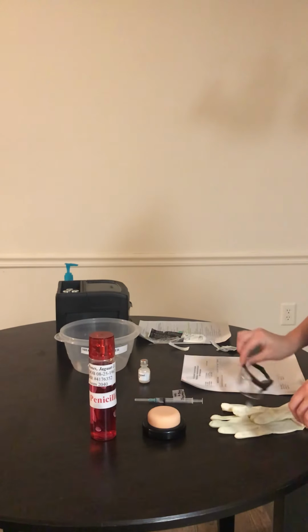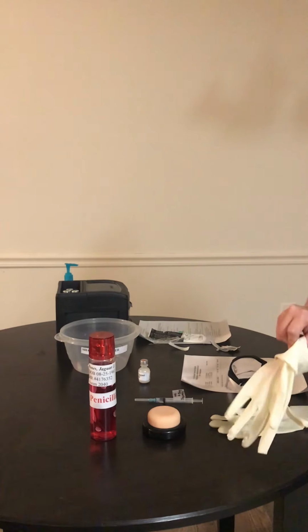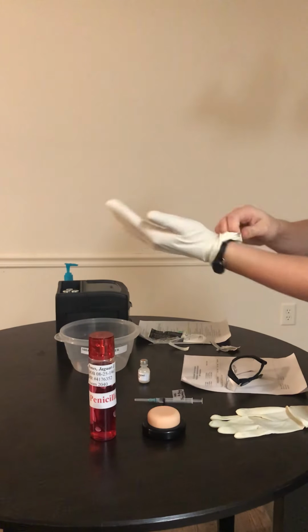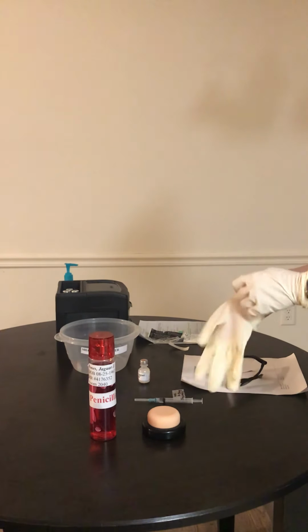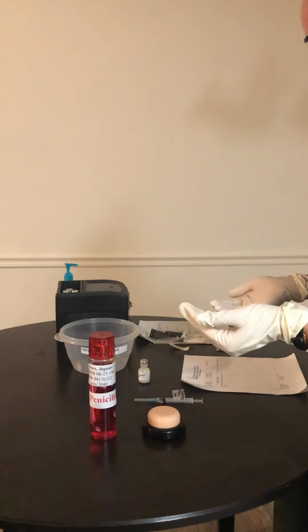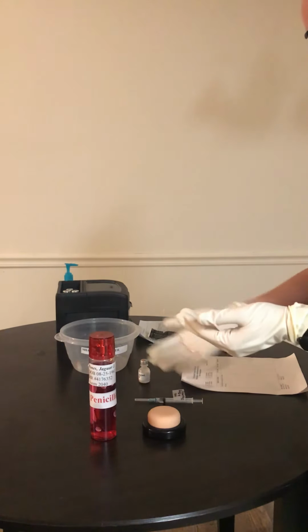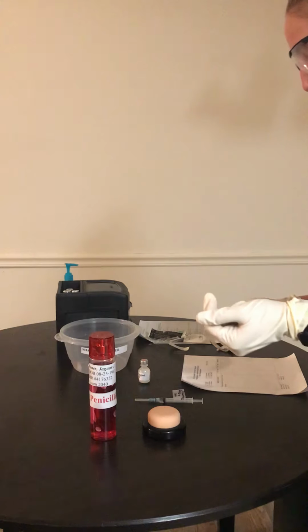The next thing I'm going to do is put on my clean gloves, and don my goggles. So after I have done that, I'm going to make sure I can see where my injection site is. I'm going to find the injection site, which should be the ventrogluteal site.